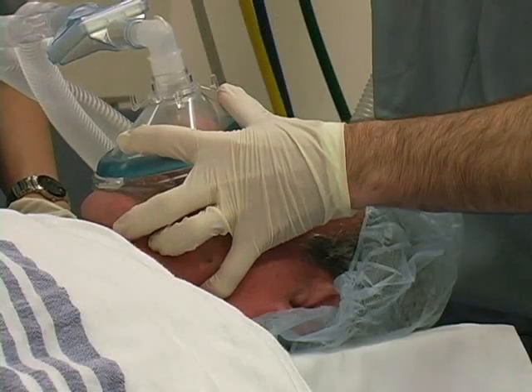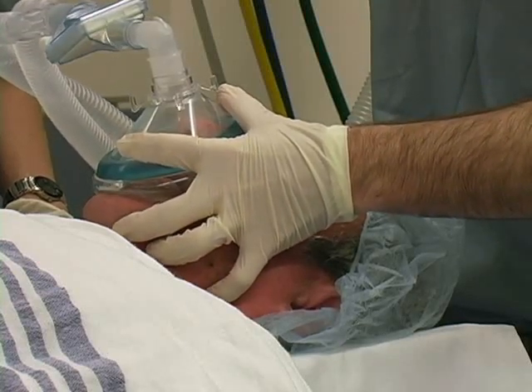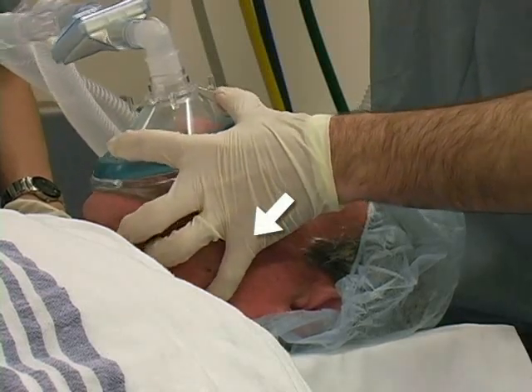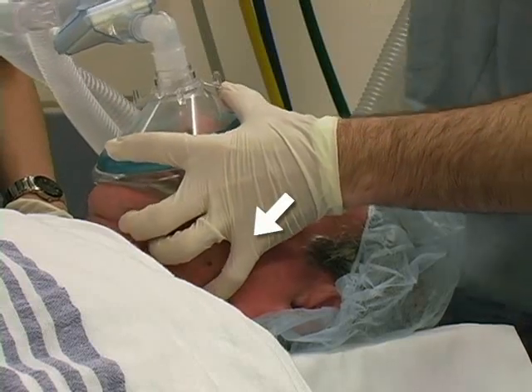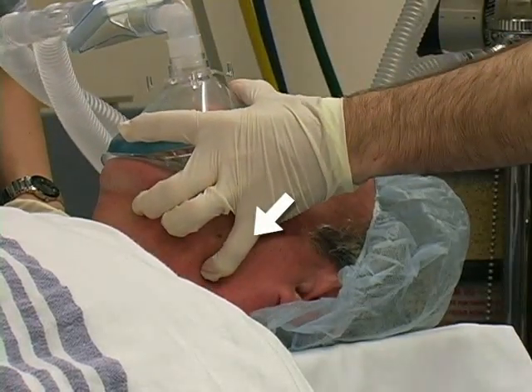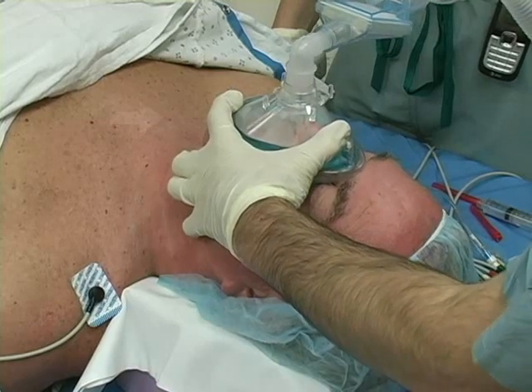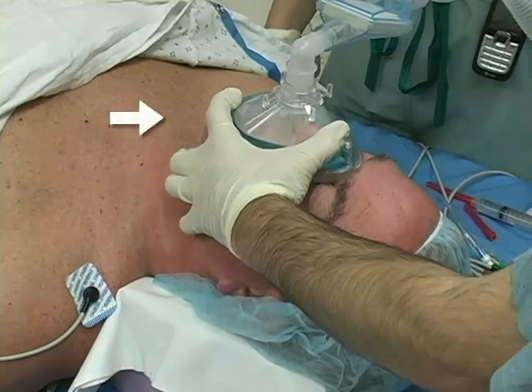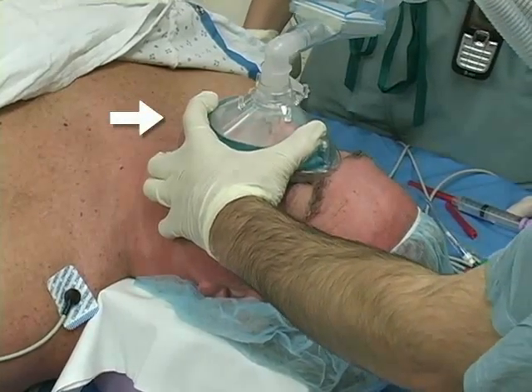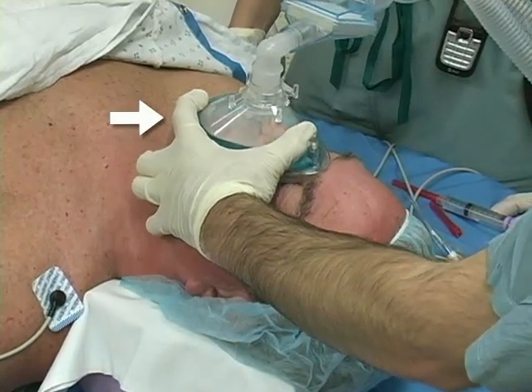One of the most difficult yet important skills for mask ventilation is correct hand placement. Position the left 5th digit at the angle of the patient's mandible. This finger needs to exert sturdy upward pressure to sublux the jaw. At the same time, the index finger and thumb create a C shape around the center of the mask. The thumb and index finger apply firm, but not excessive, downward pressure on the mask's surface.